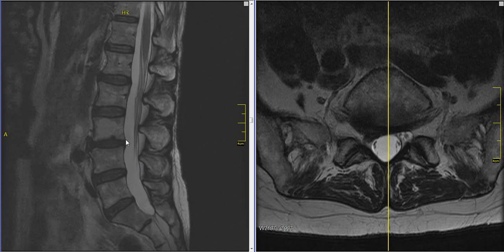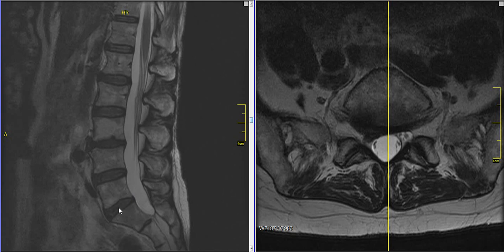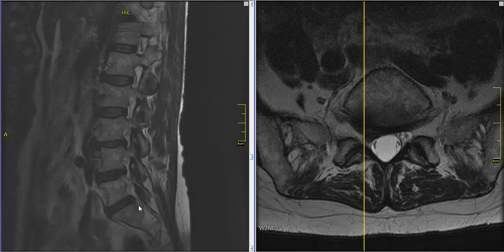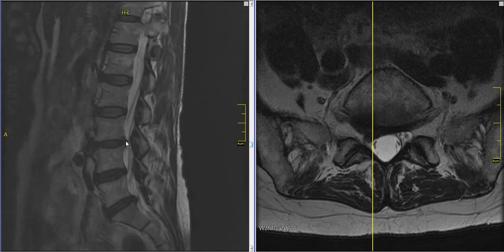Now frequently MRI scans will have little things like this that I'm pointing to at the L3-4 level that look like they could be significant but actually are not. And we'll see why that's the case in a moment. In this person, the problem is at the lowest level here, L5-S1, where about 45% of all disc herniations occur. And as I scroll over to the side here, we see a little bump on the back of the disc space. It doesn't look any more significant than that one, but I'll show you in a moment why it is.